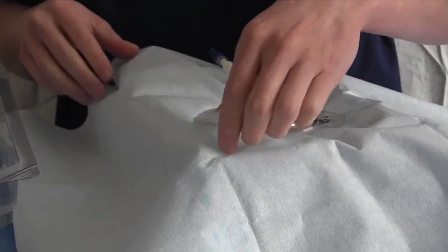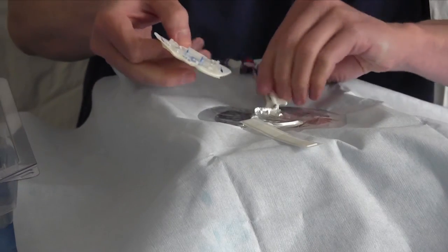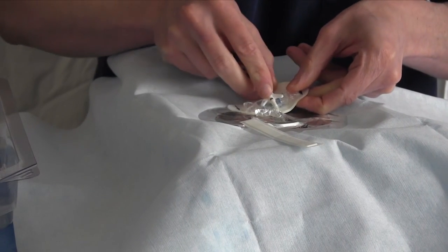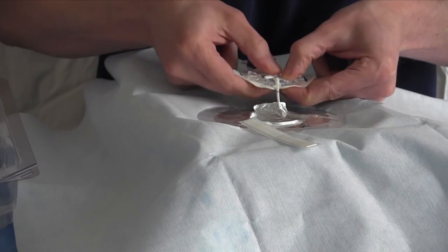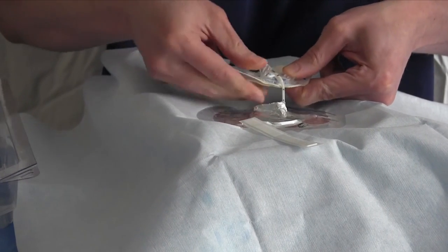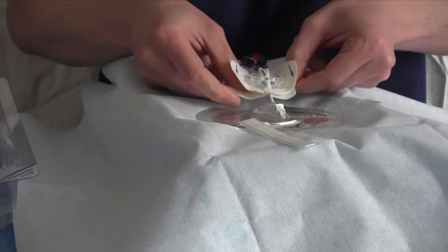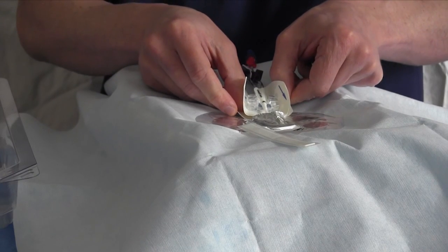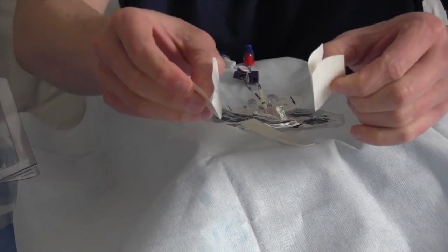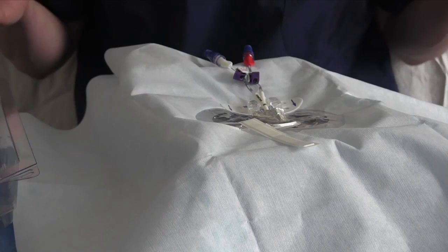Let that dry. And now you take the StatLock, and I actually like to lock it around the hub of the midline first before putting it on the skin, because it's easier to do this in the air, and just lock it around the hub. All right, now the hub is locked into this bad boy. And then what you could do is pick out your skin landing site and just spread these two little pulls. And that skin prep makes this super sticky. And now it's secured, and that's it.